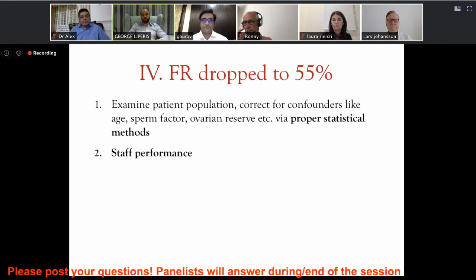For example, for IVF, it's a very simplistic method, the sperm preparation. However, we have to look at whether we're counting properly, especially when it comes to concentration of the post-prep sample. It could be that we are undercounting the sample, and we can identify that if the rate of polyspermy has risen. It's also a good example of checking that the staff are following the right instructions.